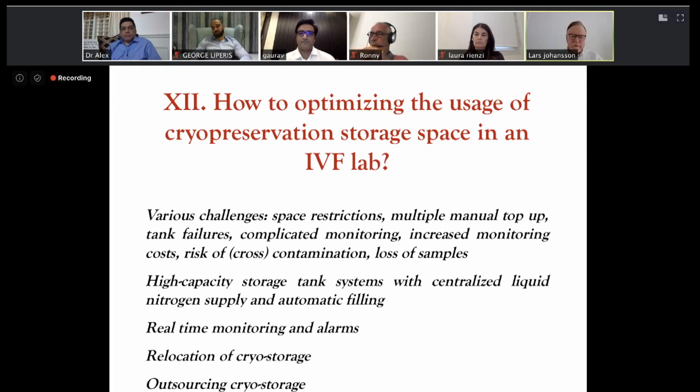The other big problem with these big cryo storage tanks is that people are leaning over and they release a lot of cells and so on from the body, and you get a lot of that coming down into the tanks. There could be a contamination, but maybe you should talk to Parmigiani, Ludovico, more about that. But I agree, it's better to have big tanks, filler tanks, and maybe have backup tanks, unfortunately. And the fillers are standing outside, so you don't have to roll them in because they're quite dirty.